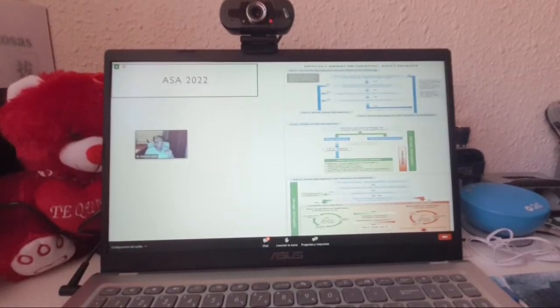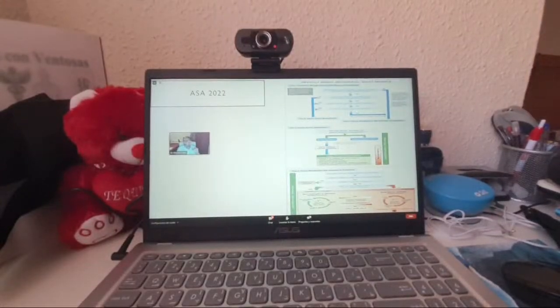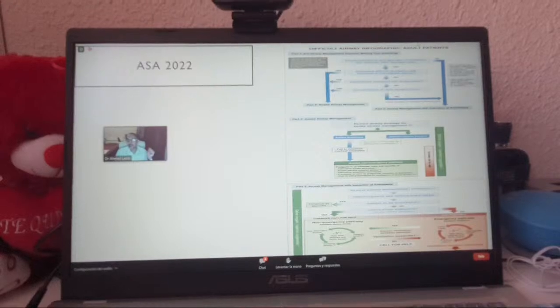Again, the awake strategy and the awake techniques are detailed in the paper. And there is more emphasis here on the emergency, and the only thing added to the airway guideline for the first time is ECMO. And this is of interest for me because I'm one of the ECMOlogists in Hamad. So the new guidelines for 2022 from the ASA, even for the elective, emphasize more on awake intubation, and that's something Marcus may allude to in his fiberoptic lecture, and the awake airway management, how to establish awake tracheal intubation, and for emergencies, the use of ECMO. And this is published in 2022.